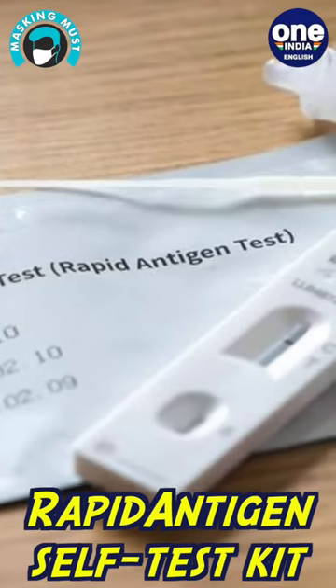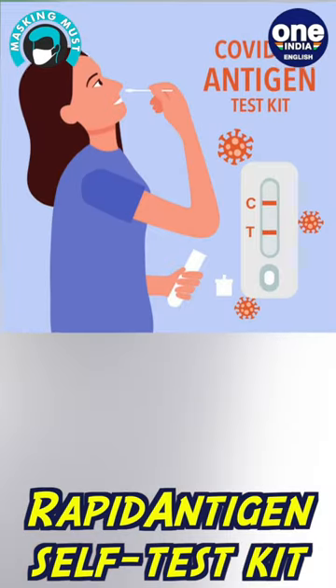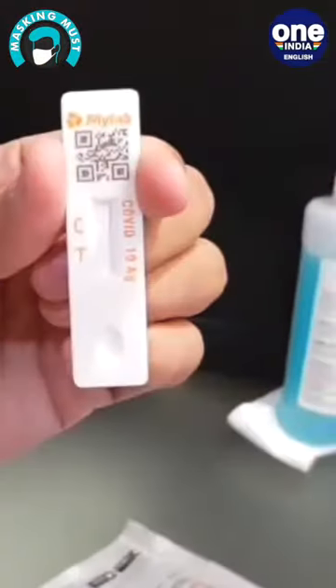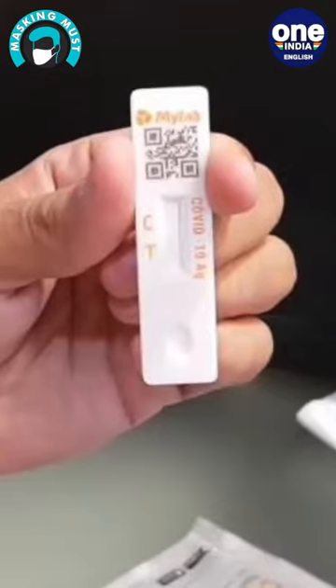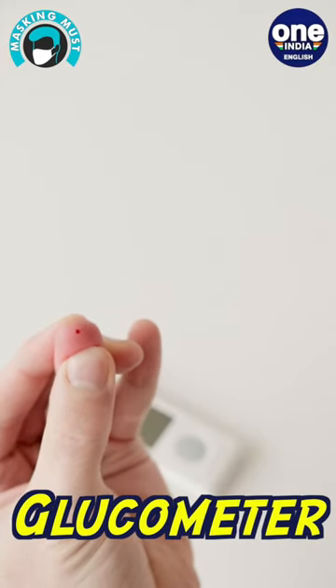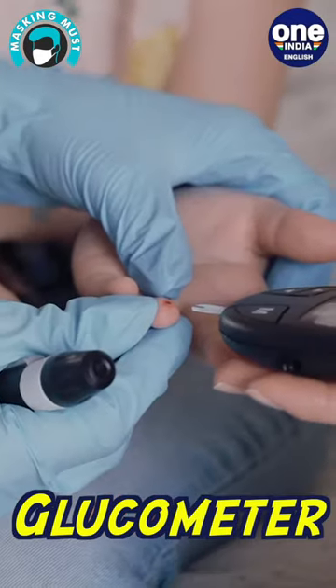Rapid antigen tests offer a quick and easy way to screen for COVID-19 at home in about 15 minutes. They detect active infections via a nasal swab, including in asymptomatic individuals. Often called rapid tests or at-home COVID tests, these rapid antigen tests can be a valuable tool for managing life during the pandemic.